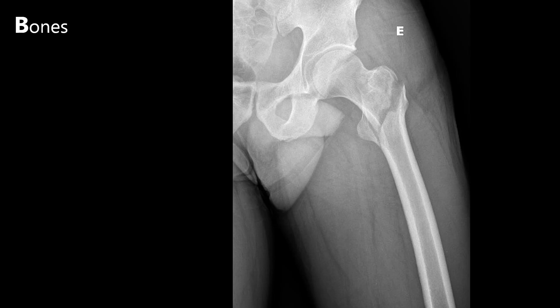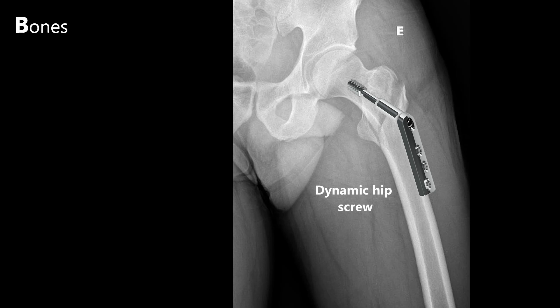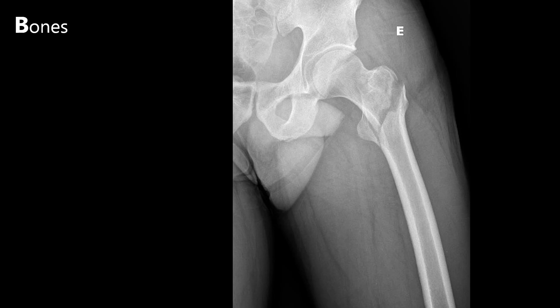This x-ray shows an intertrochanteric fracture, which is extracapsular. This could be fixed with a dynamic hip screw. The lesser trochanter has also been completely displaced.